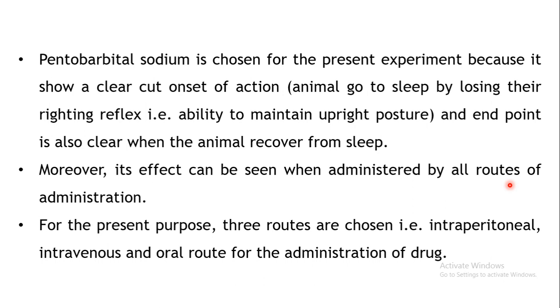Whatever route you choose, the righting reflex will be lost. So it's very easy to identify the onset of action and for how long the action is lasting. The routes we have chosen for this experiment are the intraperitoneal route, intravenous route and the oral route of administration.